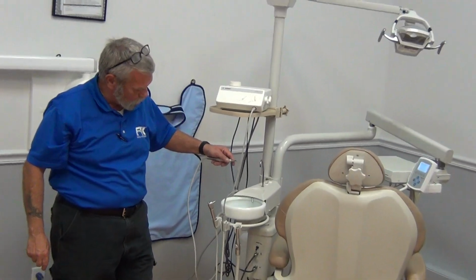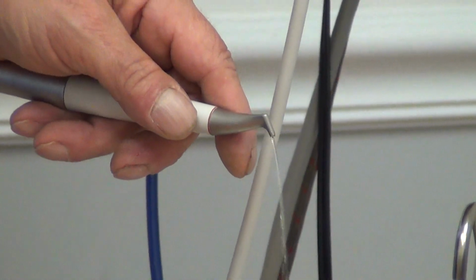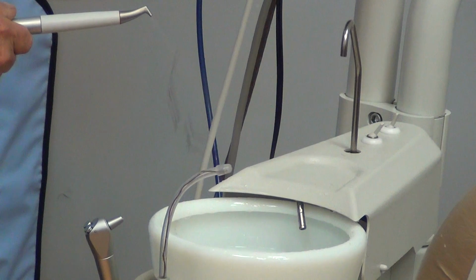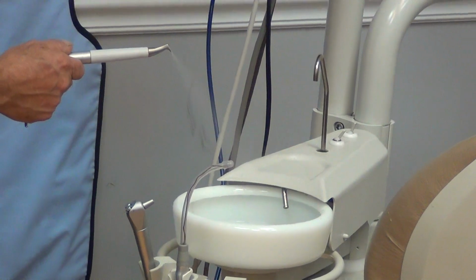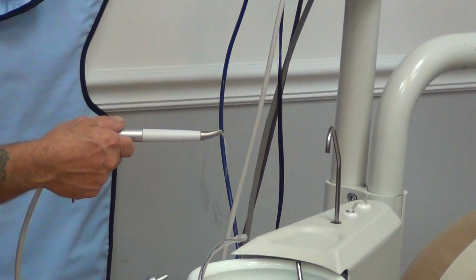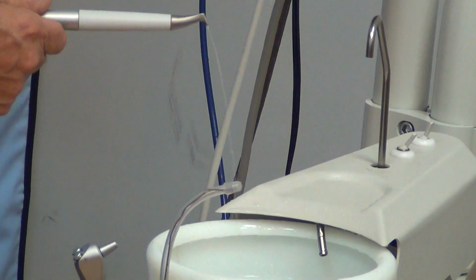Halfway depressed, the foot control is water rinse only, heated water rinse, and we have plenty of water. All the way to the floor is your slurry mixture, your powder, water, and air, to form the abrasion to clean the tooth surface. We have a nice halo, meaning the spray of the water. You can also adjust the water down. And we can also adjust the water while we're only on the water function. See, there's maximum stream, minimum stream. Max, minimum, max, minimum. Very easy.